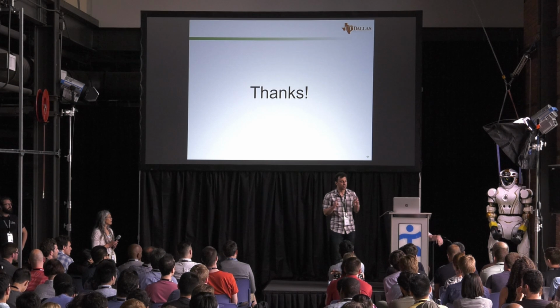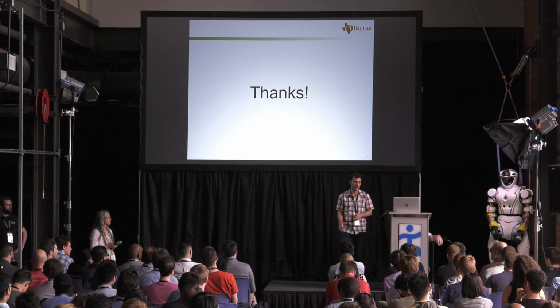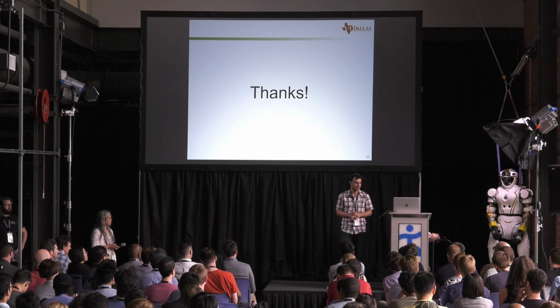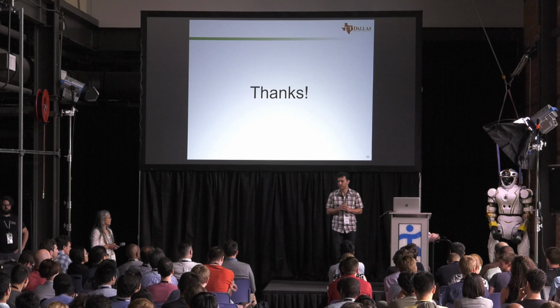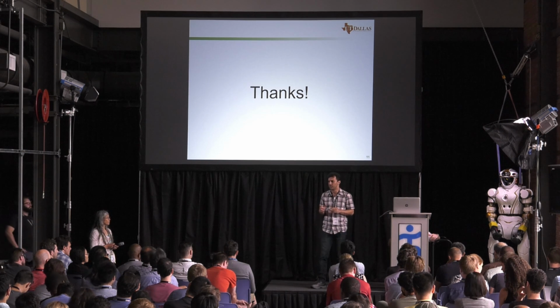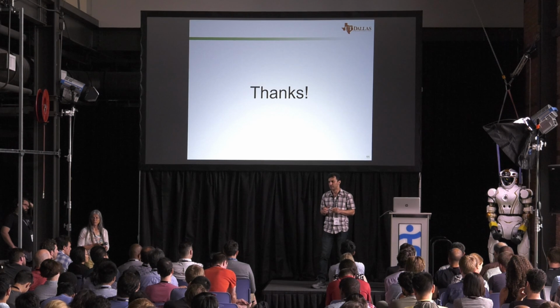Well, the thing is that when you have a holonomic constraint... What's a holonomic controller? It's not a holonomic controller per se, it's a holonomic parameterization, meaning that you parameterize the knee and ankle trajectories based on a constraint to the thigh, which is holonomic. So when you do that, it requires that the joint velocities become zero at the same moment. Whereas in human gait, it doesn't happen.